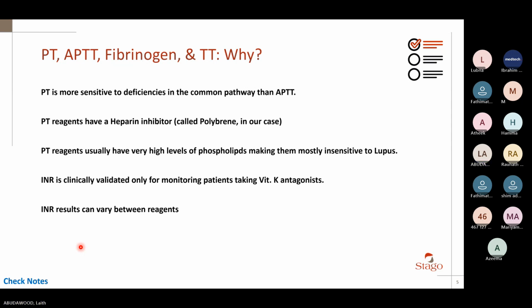Not really. Because the original INR studies used extraction PT reagents, which means the validated INR ranges that you have now were originally based on extraction PT reagents. Which means that INR reported with extraction reagents is, more or less, in a way more accurate. It reflects the patient's status a little better. Now, I'm not saying that recombinant reagents are bad. No, there are a lot of ways to mitigate this difference.